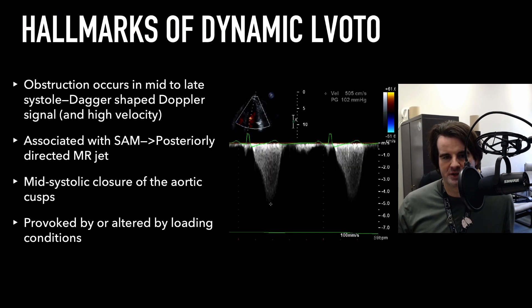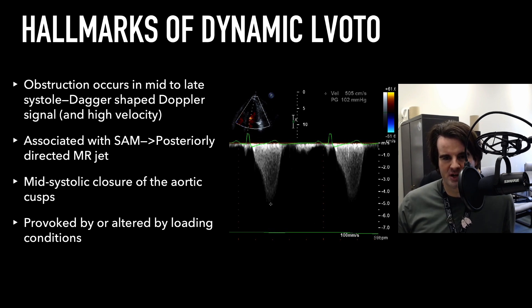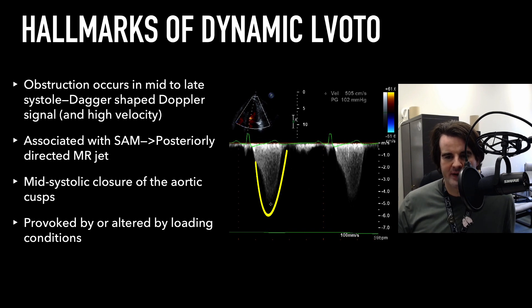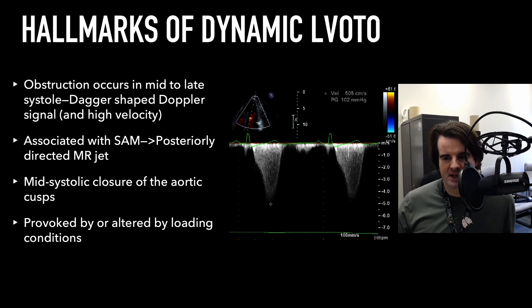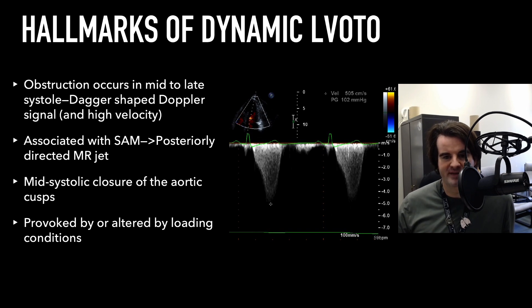Let's explore the advanced approach. The hallmark of dynamic obstruction is this mid- to late-peaking dagger shape on continuous wave Doppler, because these are very high velocities. We see a concave-to-the-left configuration — rather than a big parabolic waveform, it's scooped out. This is because there's progressive acceleration of blood flow as it tries to escape the ever-tightening grip of the outflow tract.